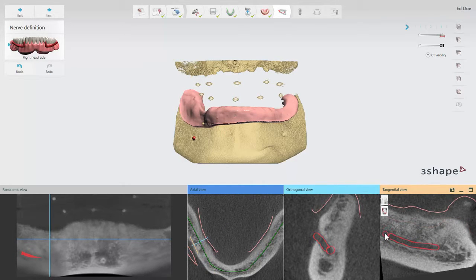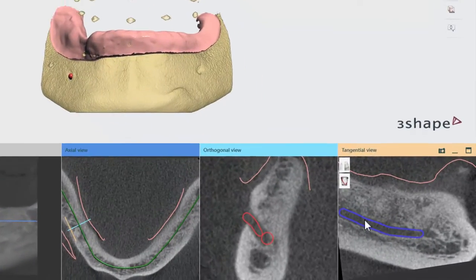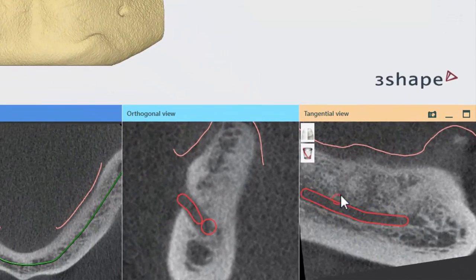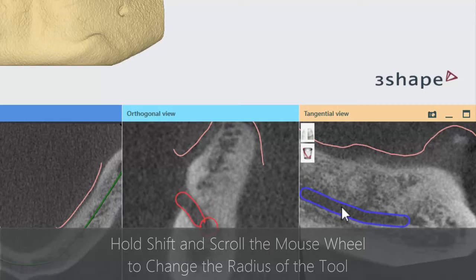To change the position of the nerve, move the cursor over it until it turns blue and drag it into the desired position. Click Clear Nerve to remove the nerve. To change the diameter of the nerve canal, move the cursor over the Orthogonal or Tangential view and scroll the mouse wheel while holding down SHIFT.